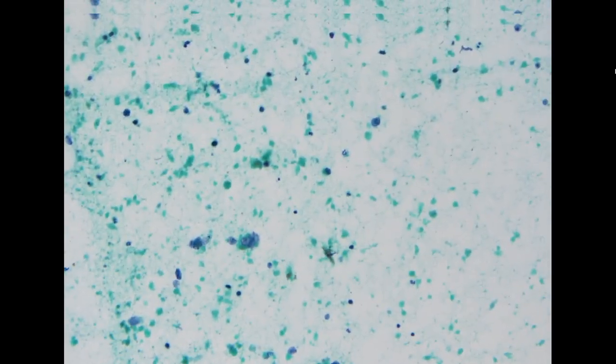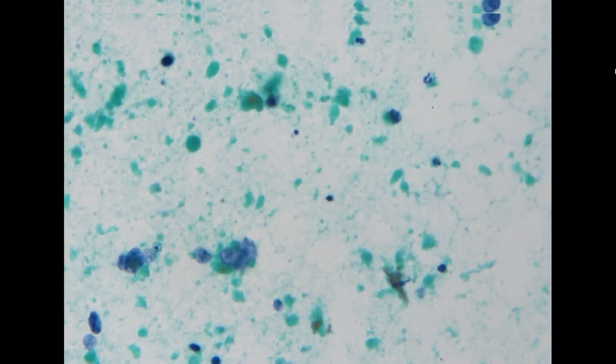Let's move to a fine needle aspiration. This is coming from a 53-year-old female, and this is from the lung. We have the direct smear for this case. It is not much, only a small area showing these cellular elements. On low power, you can already appreciate that in the background, it is highly necrotic. Most of the specimen shows this necrotic debris.